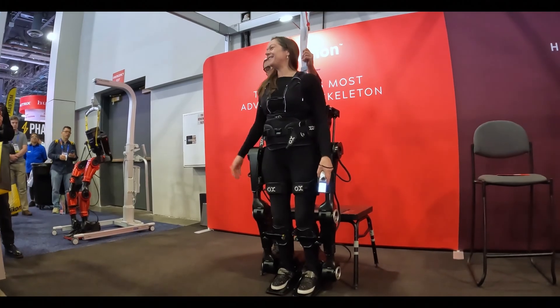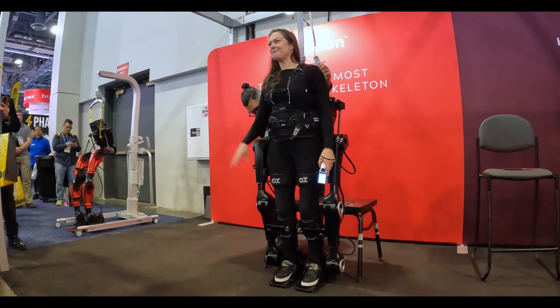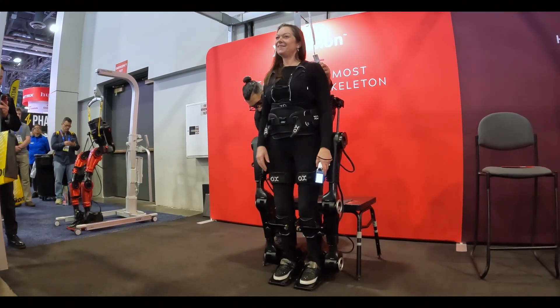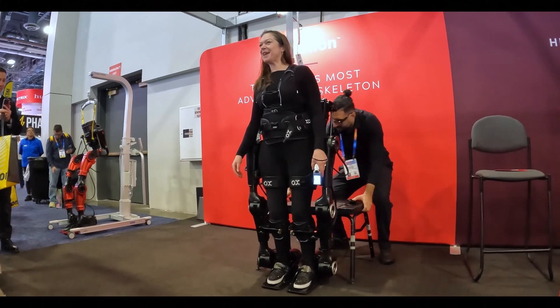That feels better. I feel like myself again. Back up at eye level where I feel like I should be. In fact, I've even gained an inch or two from when I was able-bodied. I'm a bit taller now.